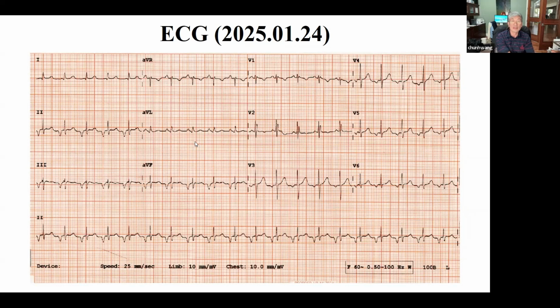Okay? Anything else you want to talk about here? So what is the differential diagnosis? Are you all saying ectopic atrial tachycardia? What's the differential diagnosis?